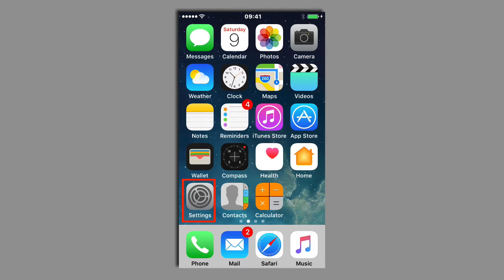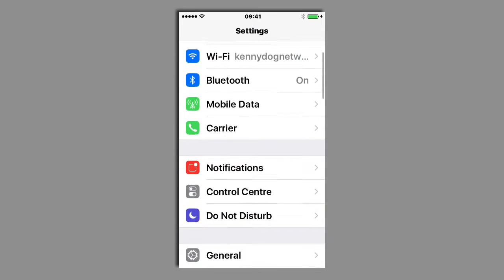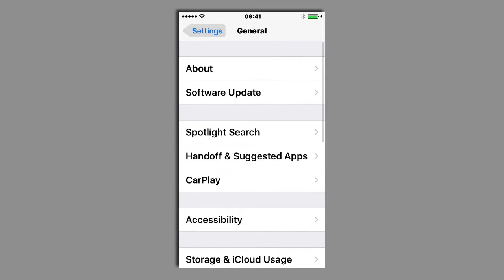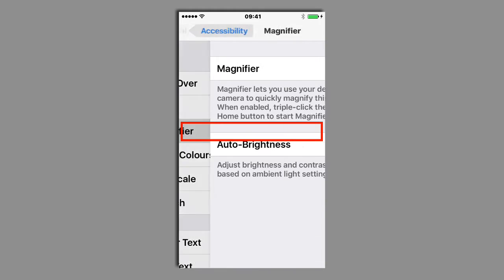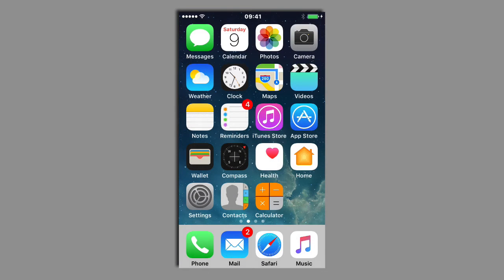To access the magnifier in iOS 10, first go into Settings, then come down to General, then tap on Accessibility and tap on Magnifier and then switch the magnifier on, and now press the home button.